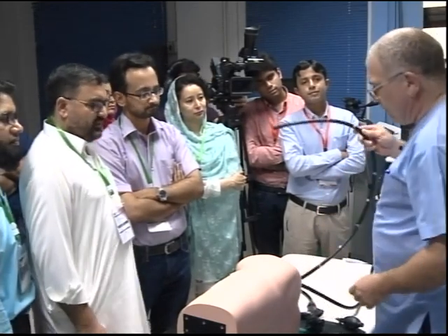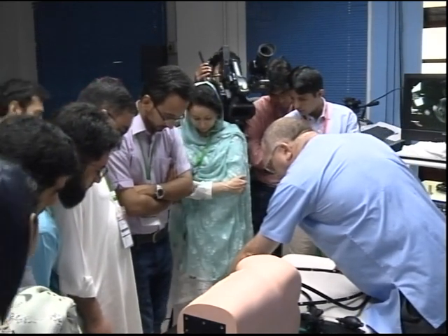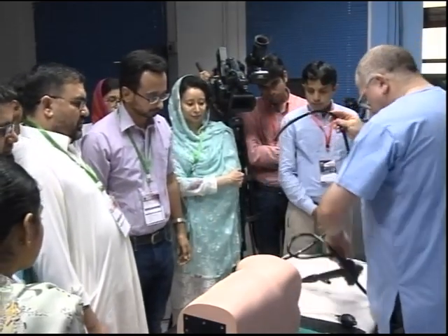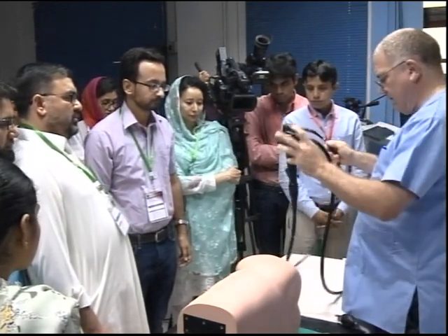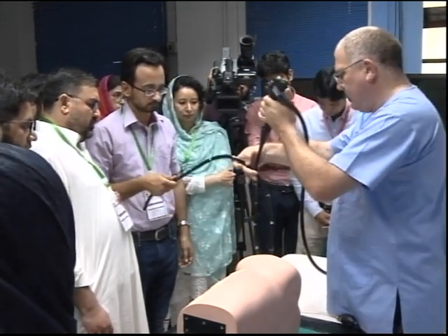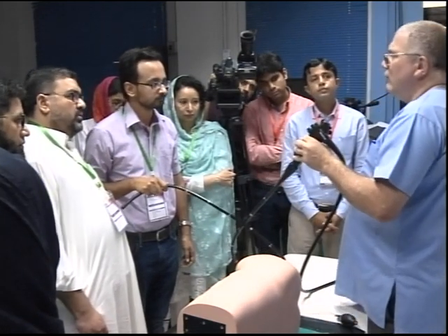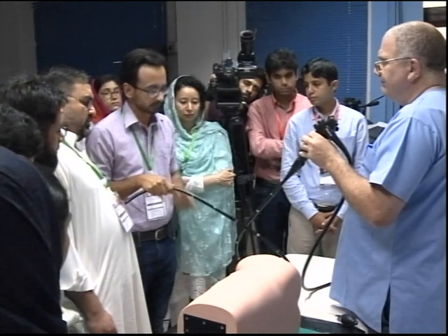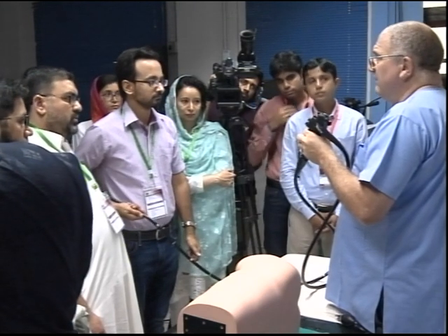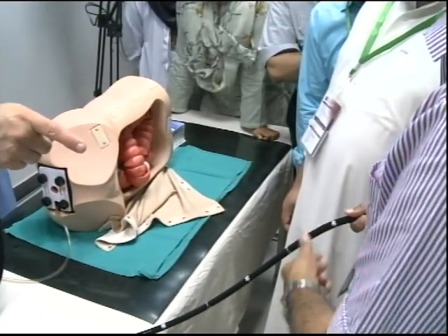What I want you to do is do me a favour. Put your feet on that line there. Toes on the line. That's it. Good man. Now, we've got the scope. Hold that in your hand. This is in the patient, and you've got the loop. So you stood there, okay? Reduce the loop. By this hand? Yeah, that's how you normally reduce it. Okay, now advance the scope. Would you do that? No, you wouldn't do that.